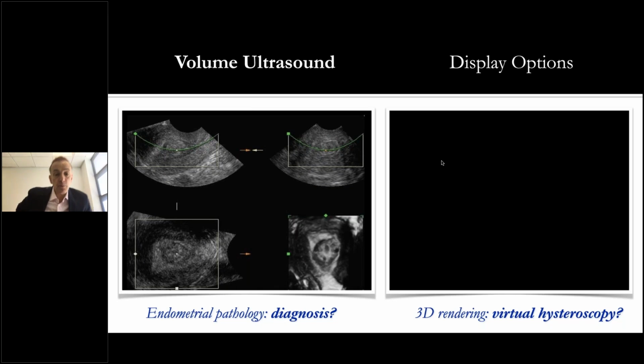So in this first image, you can probably guess that the fibroid is affecting the cavity, but when we've acquired the volume and we look in 2 planes, we can see in the C plane at the bottom, yes, there's a fibroid. By rendering the image, we're shining some light to accentuate the tissue density and the contrast between the endometrium in white and the muscular tissue of the myometrium in black. In between, we have this fibroid that has an endometrial covering on it, but this is essentially a more solid structure.